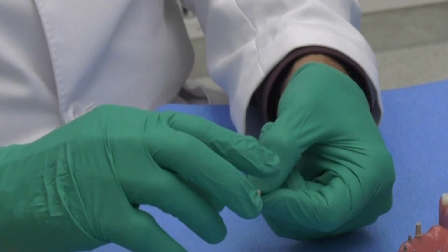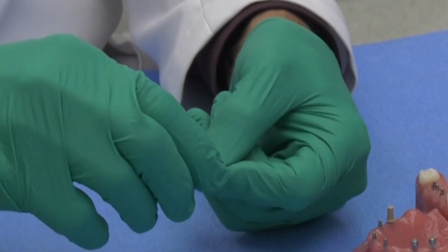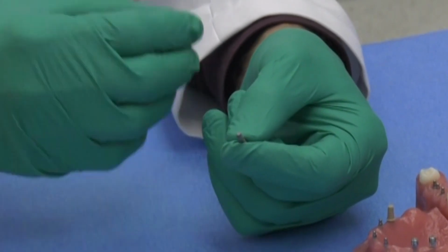Then we light cure it, polish it, you'll check the bite, and that's their temporary. And then when the patient returns, you're able to most likely remove it with just a spoon excavator or a pair of hemostats, and the shim will come off with it, leaving you the clean abutment to just go ahead and cement your permanent crown.